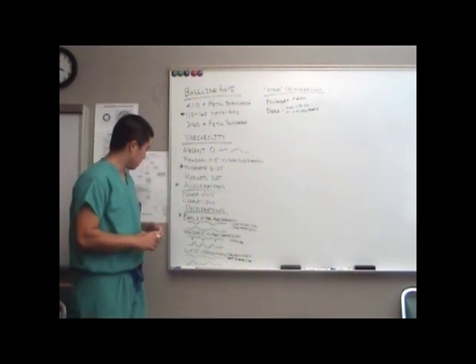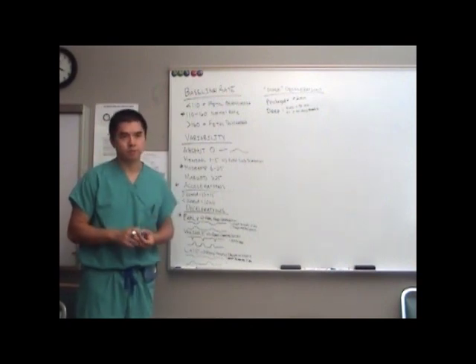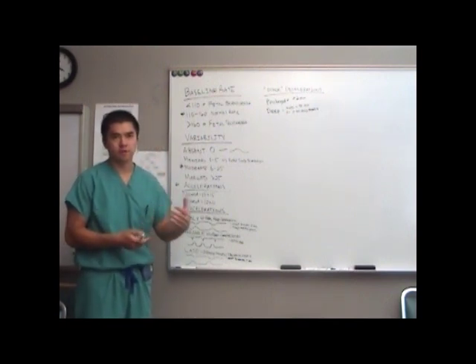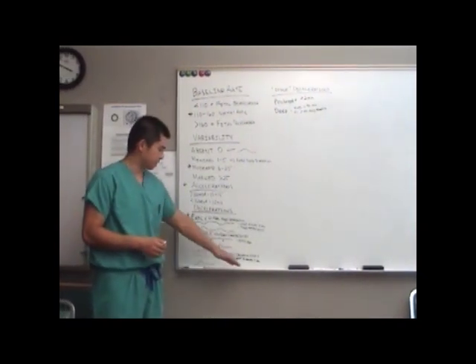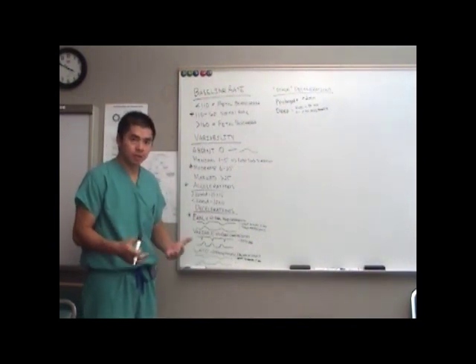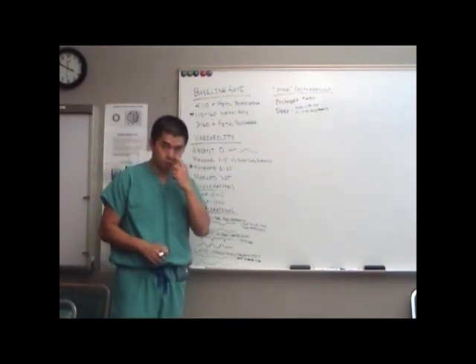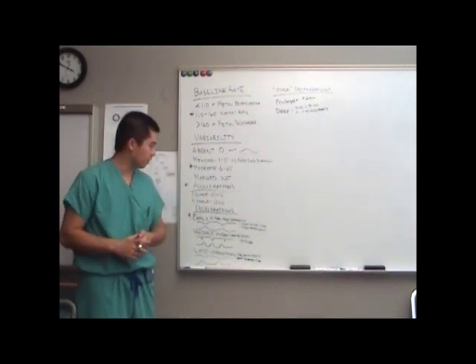So you might also hear the term subtle late used sometimes, and that's also not a term. So again, like I said earlier, a late is a late is a late. It doesn't matter if it's subtle or if it's obvious. If it drops below your baseline and meets the criteria for it being gradual and the timing of it after the contraction, then it's a late. So even if it drops below just 5 below your baseline. That's why it's important to know what you're calling your baseline so that you know whether or not you have a deceleration or an acceleration there.